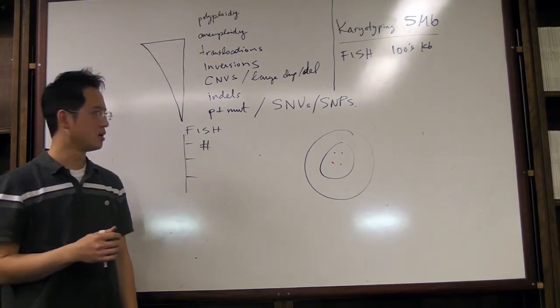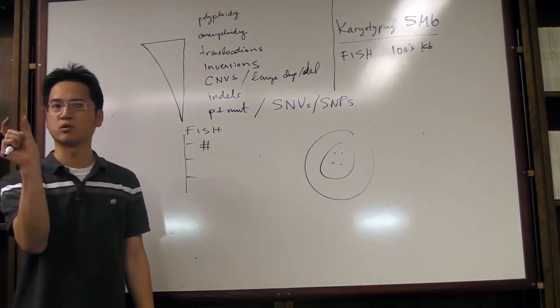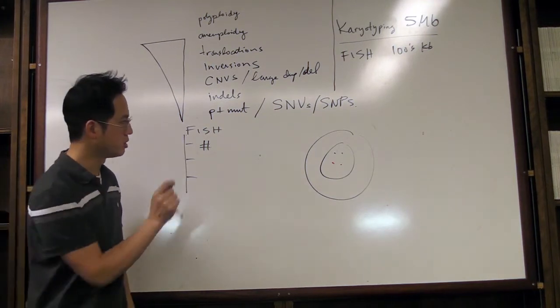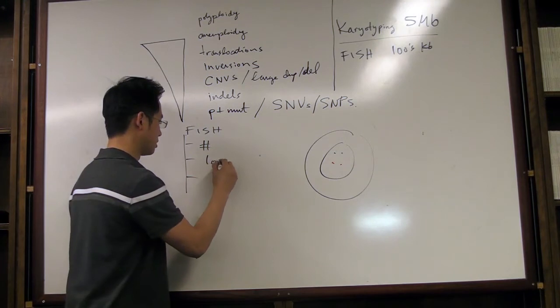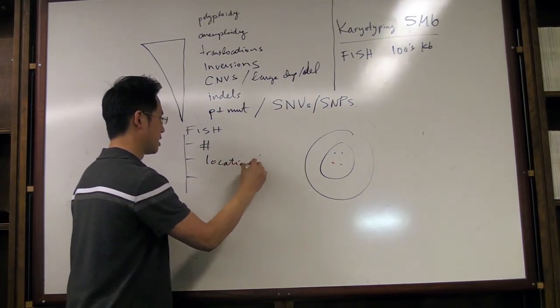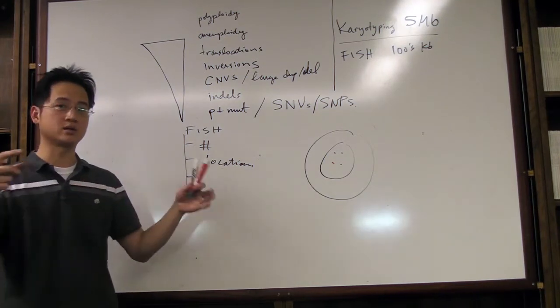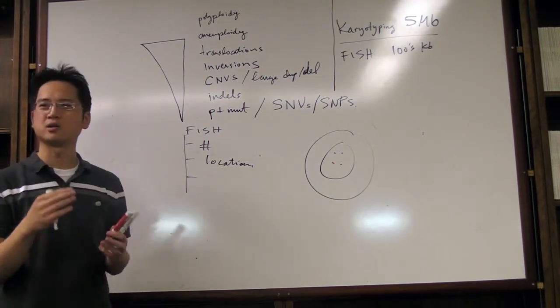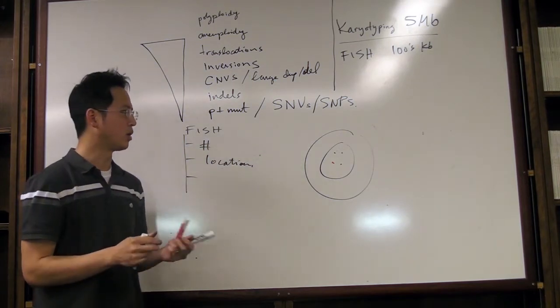I can say that. And the 2 greens are separated by about 5 diameter probe distances. Similarly, the red also shows about 5 probe diameter distances. So location. And then something that I usually always say is not very obvious is the intensity, right? How bright the signal is. It's very hard to keep that consistent doing tissue section and things like that. So we don't rely on it as much.